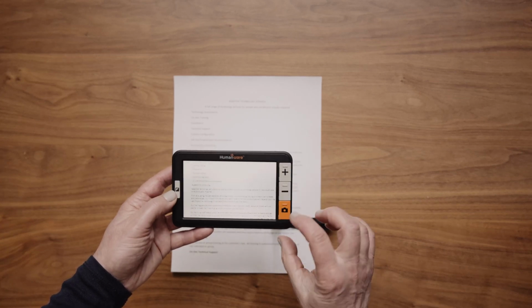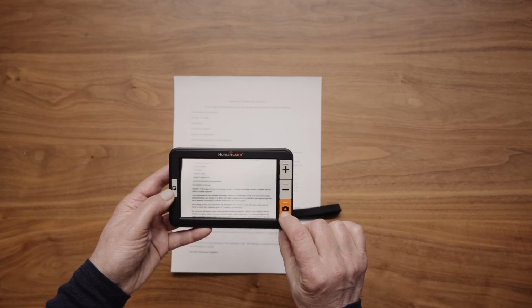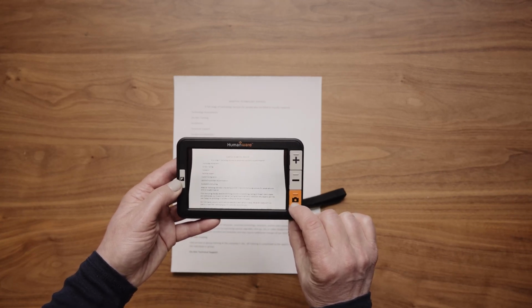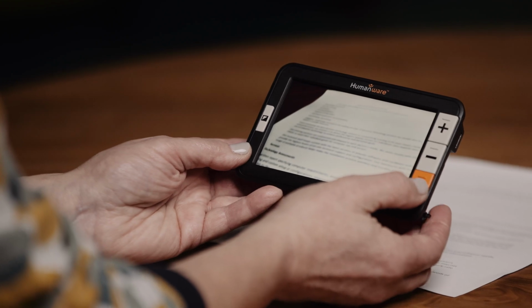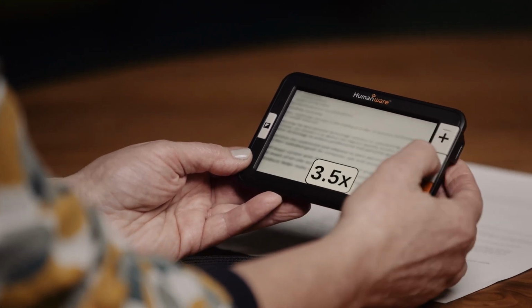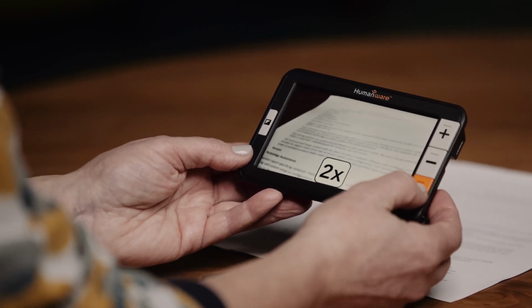Freeze an image. This is a helpful feature when trying to access images that are difficult to reach. For example, you might want to see a price tag on a shelf. You can freeze the image, then bring it to a distance that allows you to read the information. You can also enlarge the image and save it for later review.